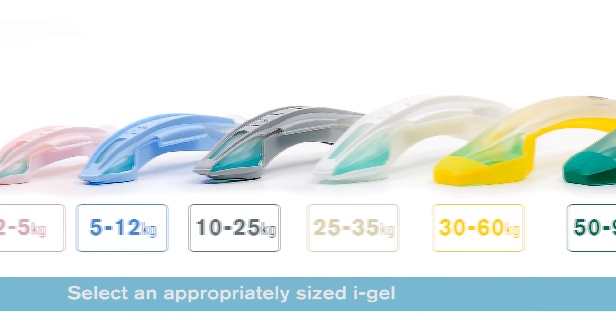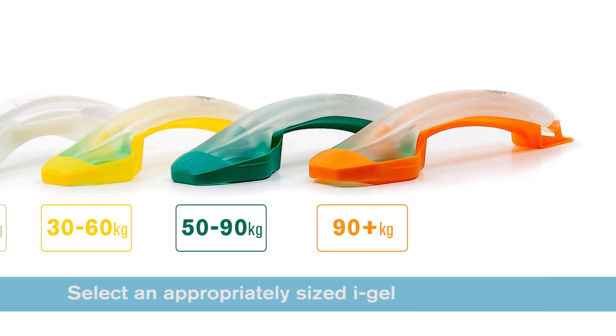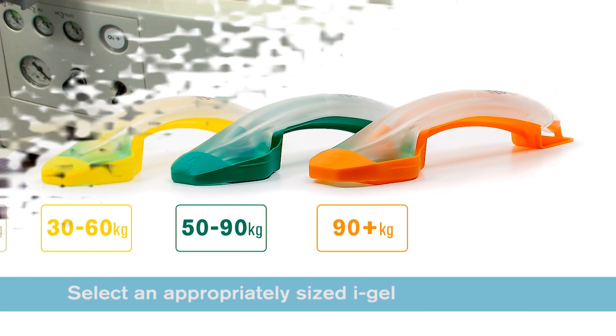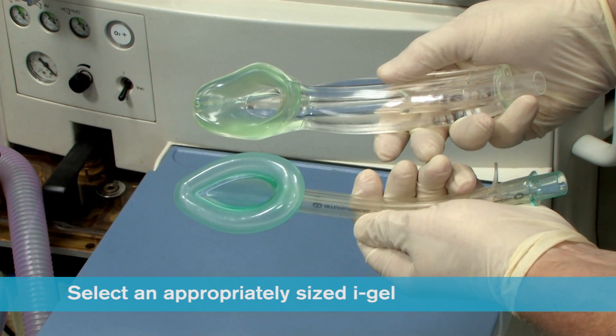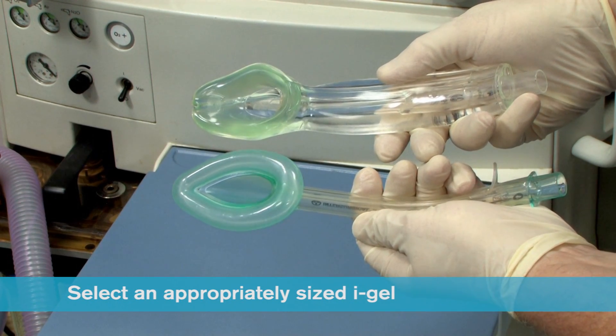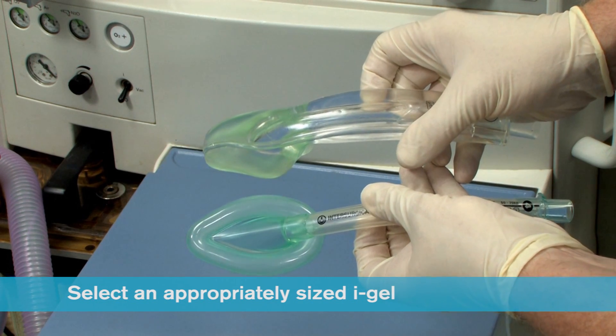Select the appropriate size iGel according to patient weight. When selecting size, it should be remembered that the iGel cuff does look smaller than the corresponding size of many traditional supraglottic airways with an inflatable cuff.